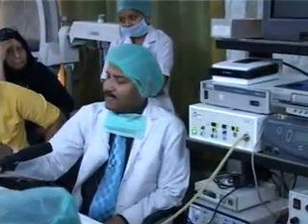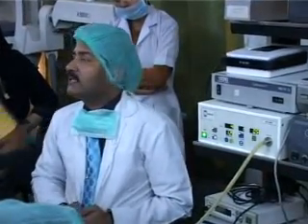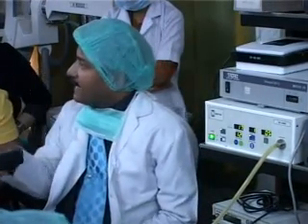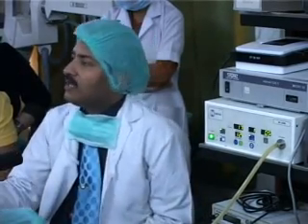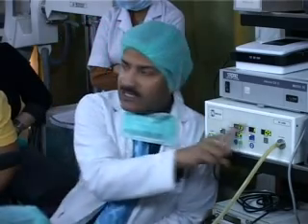One advantage is it gives time to our body to acclimatize with the increased pressure. When the diaphragm moves up, it will push some gas. When the diaphragm goes down, it will stop. It will try to synchronize with the diaphragmatic movement. This is the first advantage of the pulsatile pressure.